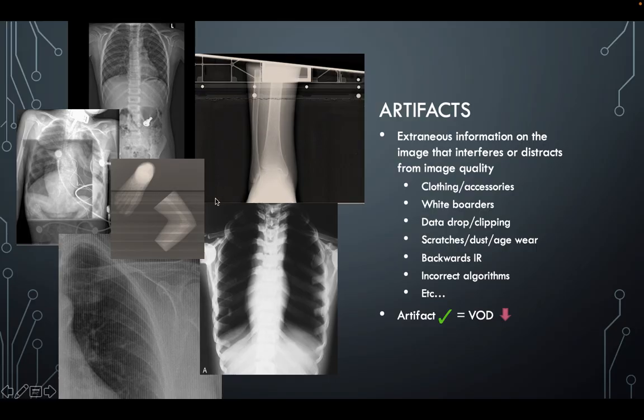Sometimes as detectors age, lines will start showing up. And that is essentially a line within your TFT array has died. The gates that allow them to send their information are either not opening or closing correctly. And so that's just kind of what happens as these things get old.